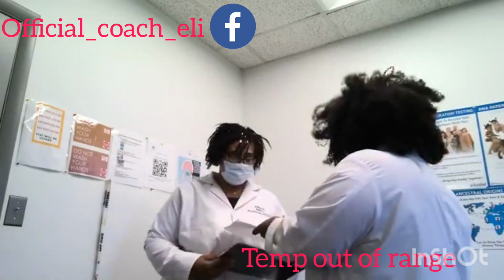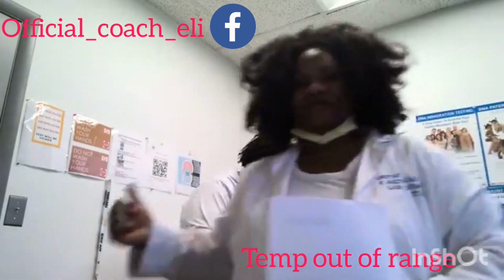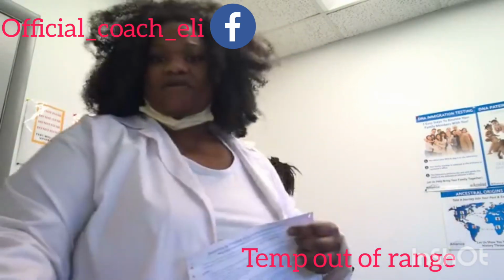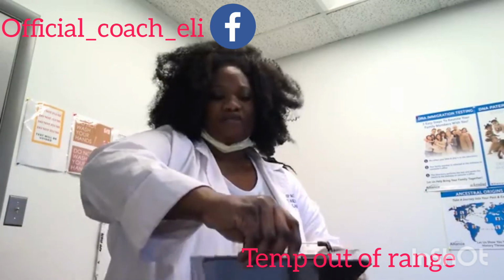All right, so why don't you sit there and continue to sign in and fill out that form. While Ashanti is doing that form, I'm going to go ahead and grab my CCF form and complete step 1.